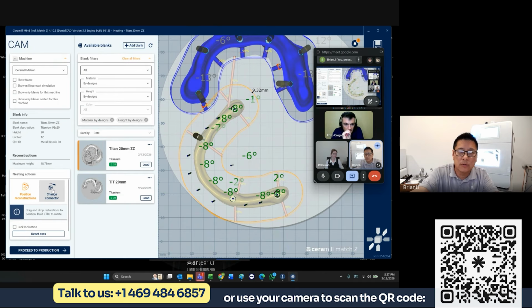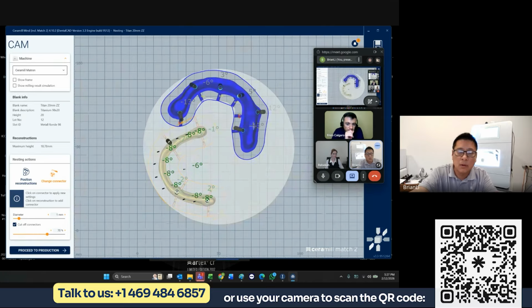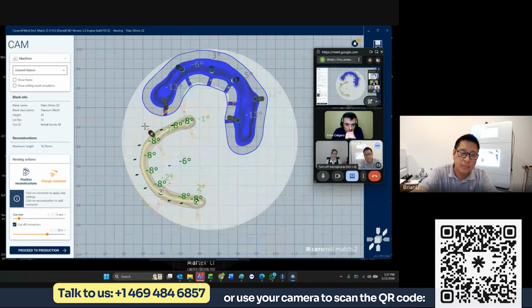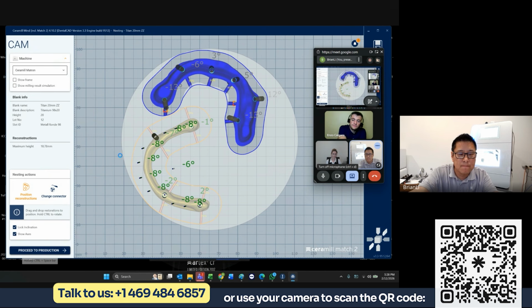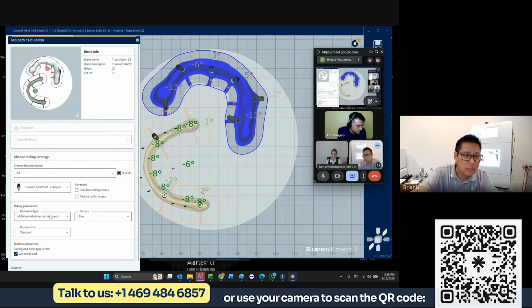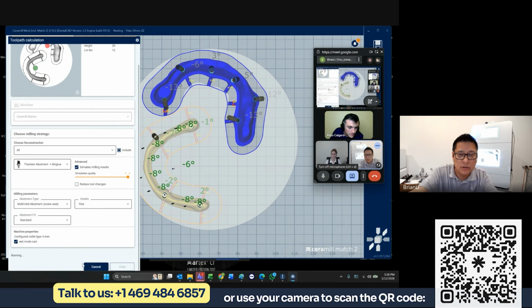So let's go. Take that off. All right, so here we'll hit next. Multi-unit, simulate, HD, start. Okay, so that will calculate, and then we can show you the simulation results after.